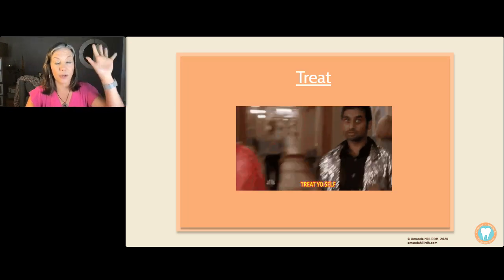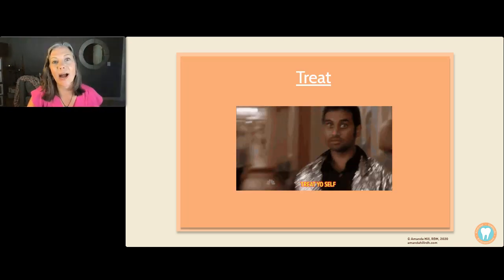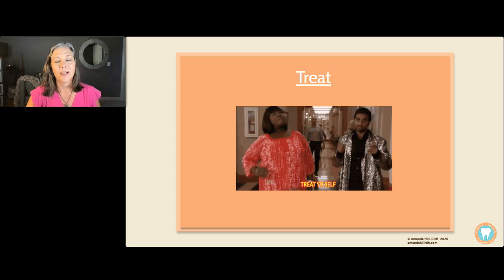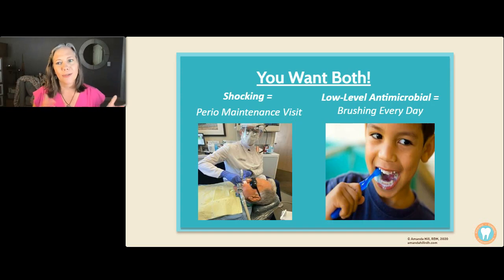Okay, so we have shocked, we have tested. Now we're going to treat ourselves because we passed, whoop, whoop, and we're going to treat our dental unit waterlines. Some people say, well, I shock, so do I have to treat? Or some people say, no, we use that straw thing, so we don't have to do that shocking part. Actually, you have to do both.